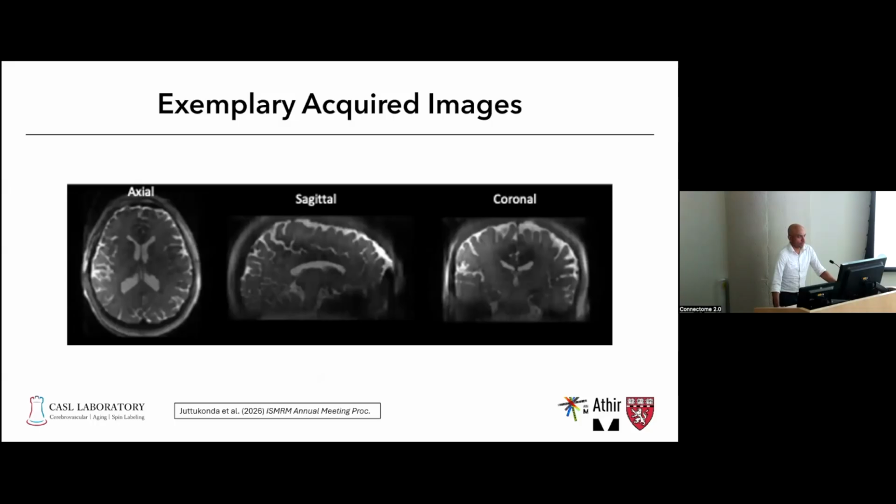Here are just a couple of exemplary images that were acquired in a 40-year-old male subject, I believe. These are control images showing in all 3 orientations that we can acquire these data at this high resolution without any significant artifacts being evident.